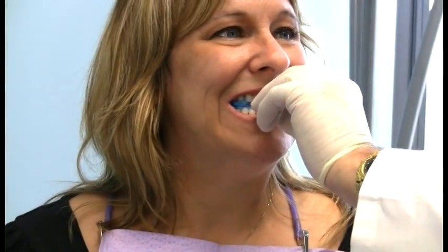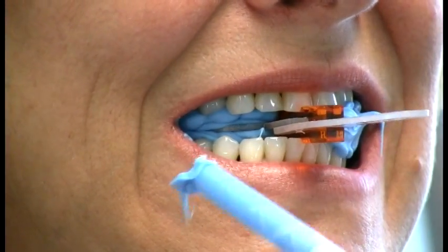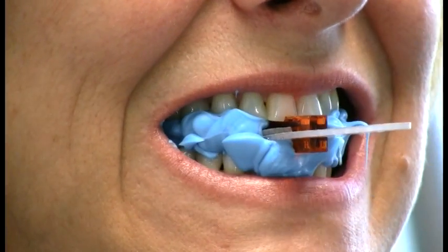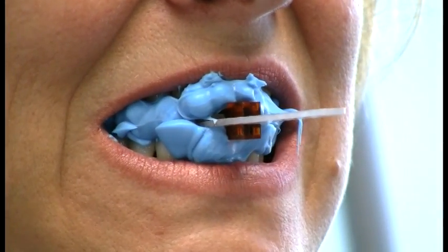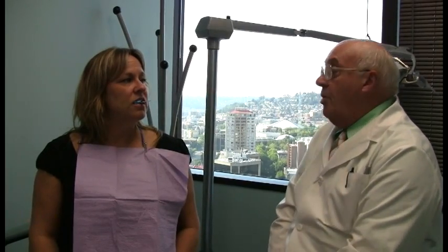Okay. Now, if I wasn't on camera, I'd be around there looking at that to verify it. So what I'm going to do now is just fill in this area right here. And now that I've already seen that we're centered right, I'm going to bring my material around, above and below. So now when this comes out, we're going to have an image. Just bring your lips around there, please. We're going to have an image of that center line in our impression material. And that's going to take about 1.5 minutes. And when we take that out, it's very easy to reconfirm once again that we're on the right-left midline.